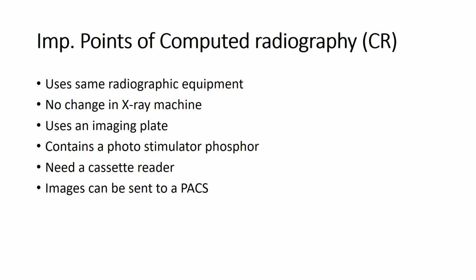Some other important points related to computed radiography: in computed radiography we use the same radiographic equipment as a conventional radiographic system, so you do not need to change the X-ray machine. You can use the same old X-ray machine, and you use an imaging plate instead of an X-ray cassette.